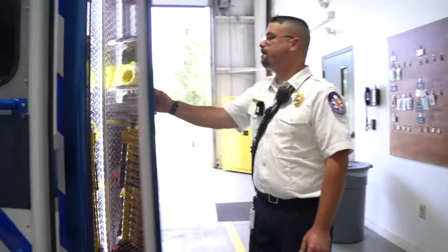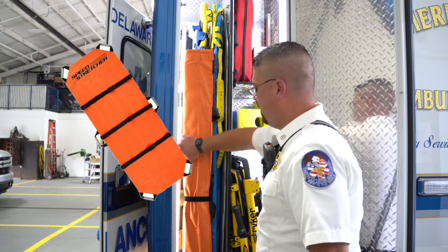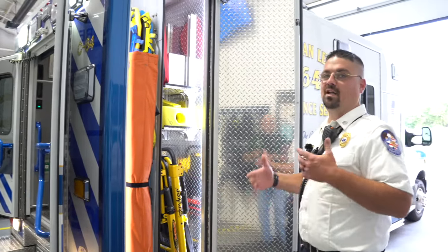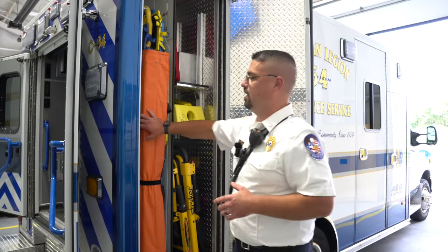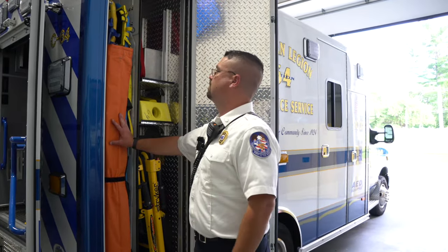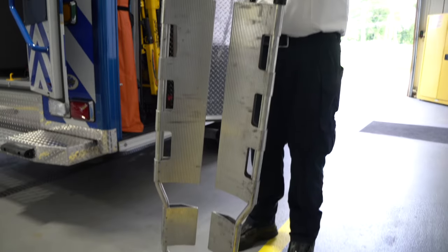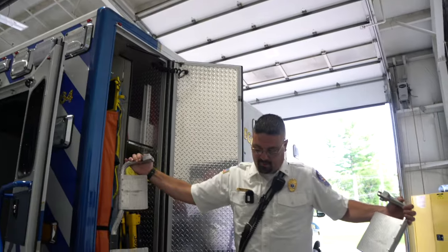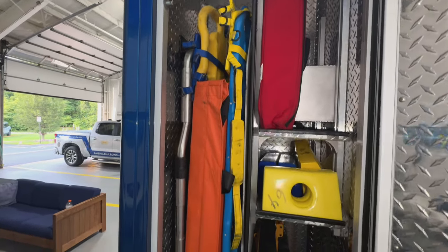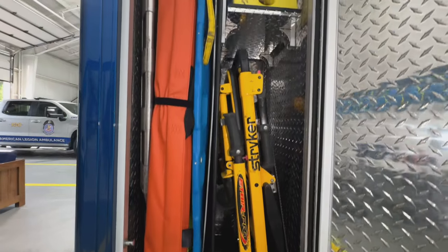This compartment is for mobilization — we have our backboards, a reeve stretcher, and a scoop stretcher. The scoop stretcher is something BLS providers sometimes forget about, but we push it a lot for the elderly with hip injuries. It actually comes apart at each end so you can scoop the patient up without having to fully lift them, and it extends to different sizes to fit every patient. Hence the name — scoop.